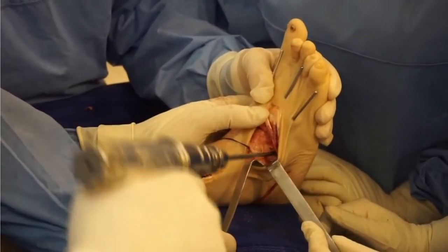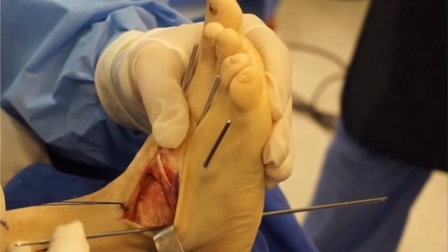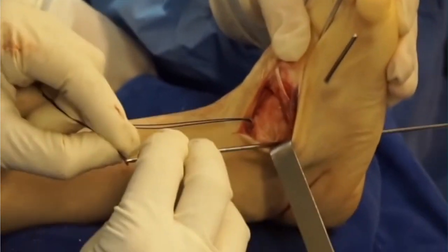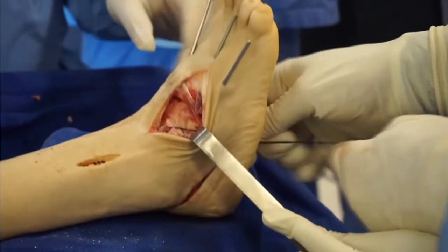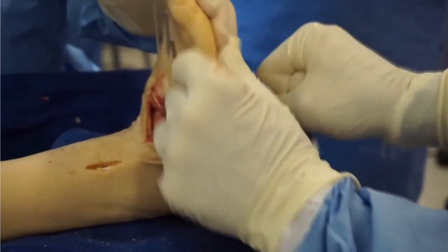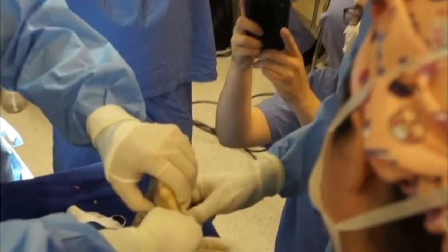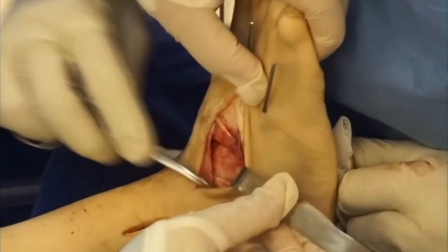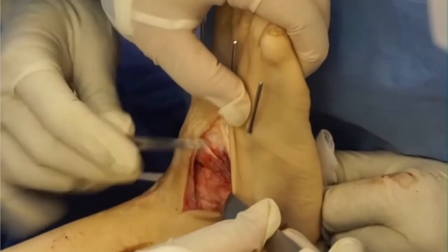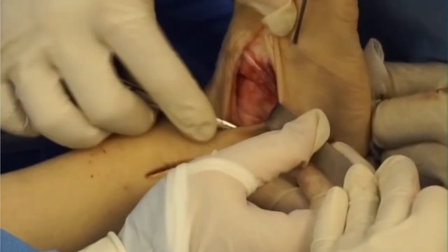My hole for the tunnel for the posterior tibial tendon is made over the cuboid with a 4.5-millimeter drill that's widened to make sure the passage of the tendon is correct. I pull it out through the plantar aspect of the foot — make sure the tendon passes easily through your tunnel — and then tension it on the plantar surface of the foot. Once you've got it secure, I'm going to tighten it over a large soft tissue sponge or bolster on the plantar surface and make sure that I've got adequate dorsiflexion, because you want 5 to 10 degrees of passive dorsiflexion with your transfer.